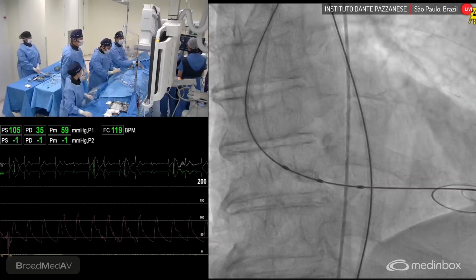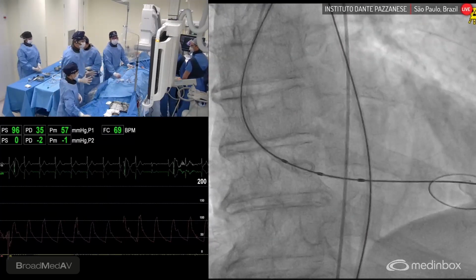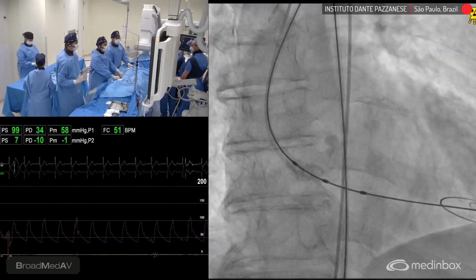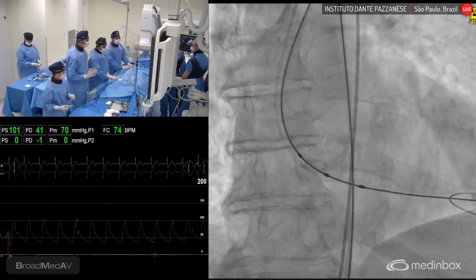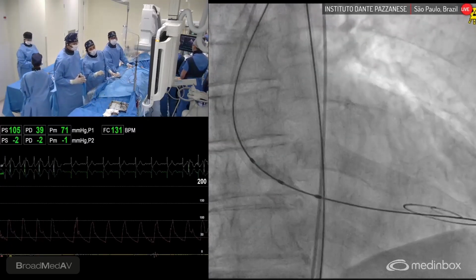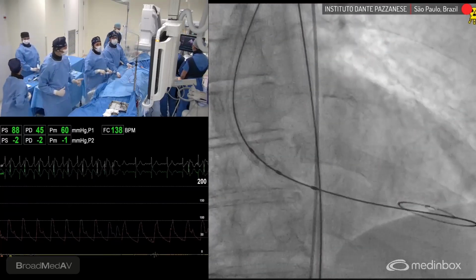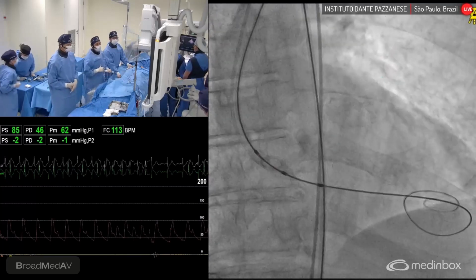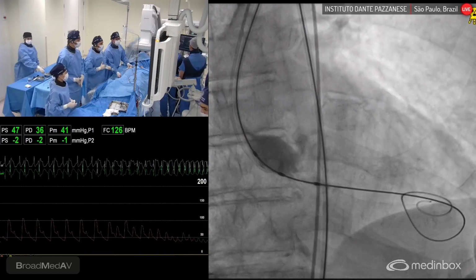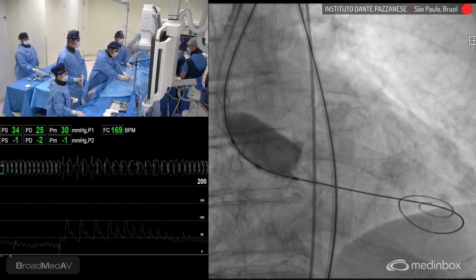So Alberto is doing the procedure while Dimitri is talking. It's very important. Alberto is so concentrated. When you are doing a live case, it's important to have two experienced operators. Pacemaker on, 100. Now Dimitri is coordinating the pacemaker, and he's going to inflate the balloon, and Alberto is holding. 180. Go ahead. Oh, it popped up. Pacemaker off.